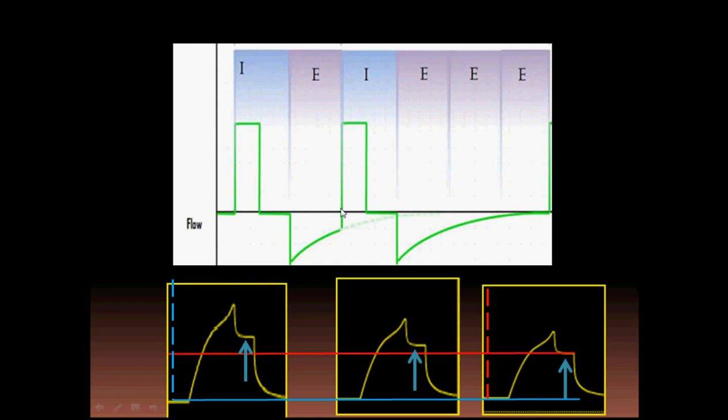So this is a very important point when you are putting a patient on muscle relaxant and he's on mandatory ventilation and you switch to assist controlled. When you awaken the patients and the patients become tachypneic, you have to act rapidly and take care that the patients might develop pneumothorax. You have to take care of this point and you have to handle it.